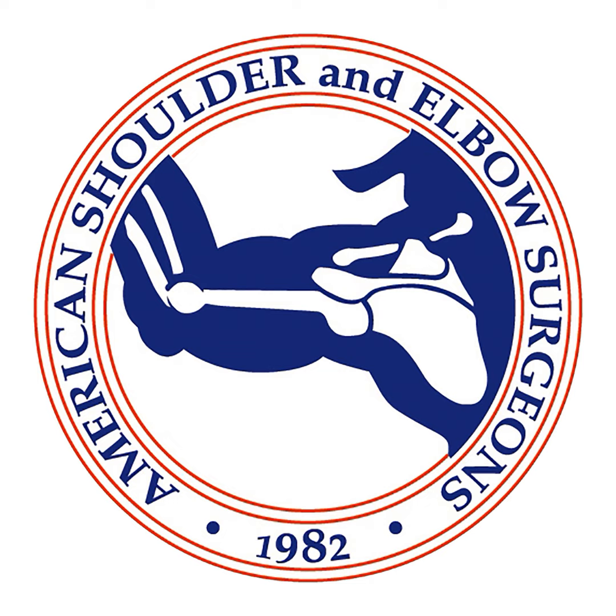I think a lot along the same lines as Peter on this one, because ideally, I think something that has structural strength and can stimulate biologic healing and gets incorporated into the rotator cuff seems like it would be really awesome, and maybe even the holy grail. And I think we're all probably a little bit cautious with fully synthetic scaffolds, just because of some that were tried in the past, and we worry about inflammatory responses and immunogenic responses. So I'm cautious of fully synthetic scaffolds.